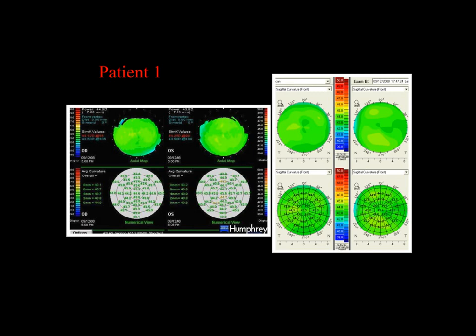And the reason for that is twofold. One is a Placido is reflective, so you get a lot of dropout if there's tear film abnormalities. And actually, Oculus put that to good use with their keratograph by developing a way to analyze a dry eye patient. And also what you'll notice is that you'll get much more coverage with the Scheimpflug.